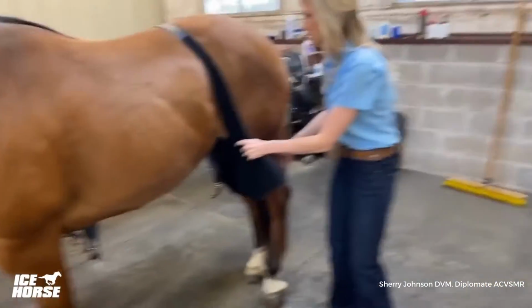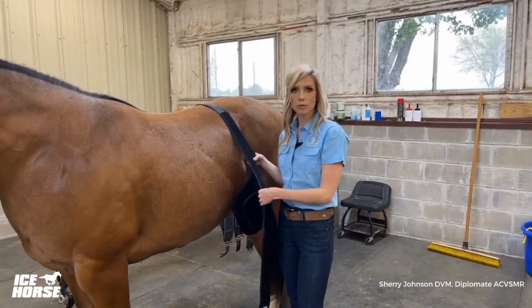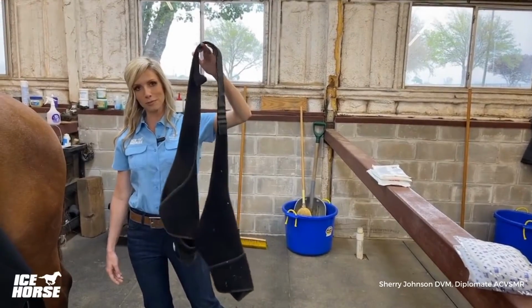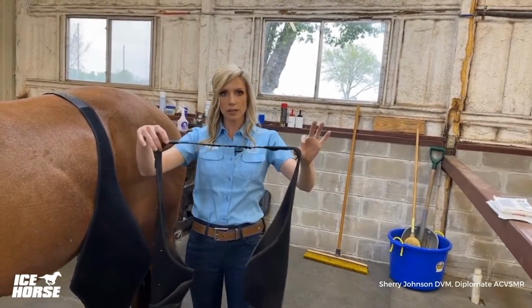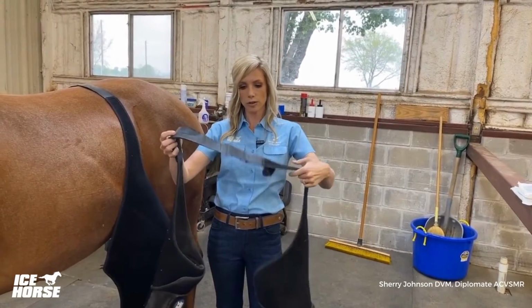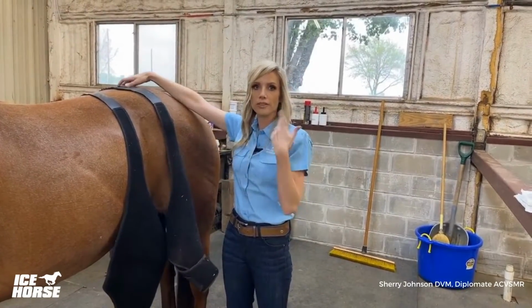So we'll just unhook this. The first thing that's noteworthy is that I actually keep the wraps connected in between uses. So you can see right here, this is our in-the-barn pair that looks much more used and abused than our nice new set that we have here. But I actually keep them connected like a set of trousers. And each of the wraps is labeled left hind, right hind, so you know what goes where. When you're in the barn for everyday use, you can simply throw them over and then get started.